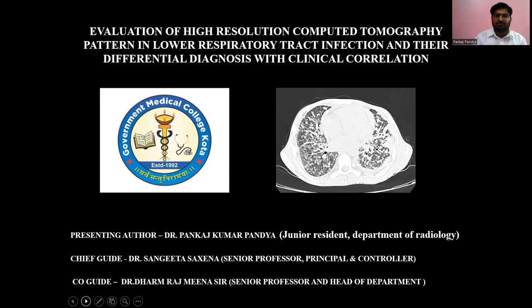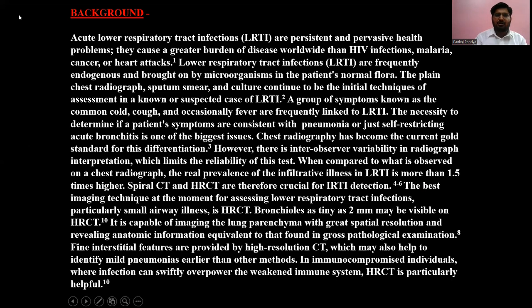Today, my paper topic is evaluation of high-resolution computed tomography pattern in lower respiratory tract infection and its differential diagnosis with clinical correlation. Background: acute lower respiratory tract infections, LRTI, are persistent and pervasive health problems. They may cause a greater burden of disease worldwide than HIV infections, malaria, cancers, and heart attacks.